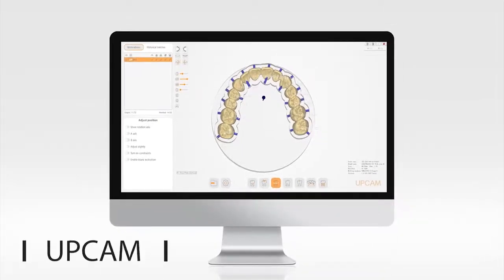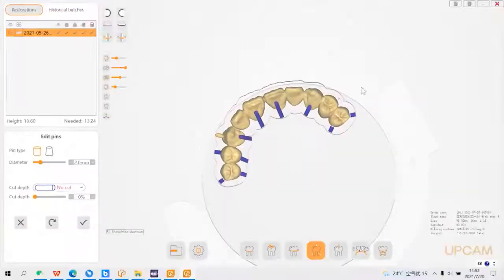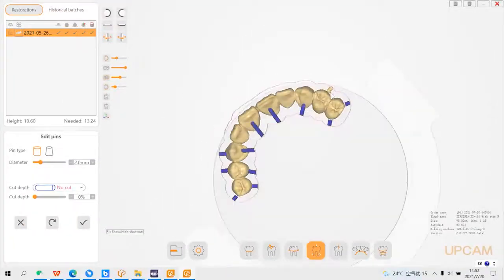UpCAD also includes a nesting software independently developed by Up3D. Simple operation and quick tooth nesting, integrated with the milling of all types of restorations of P53.